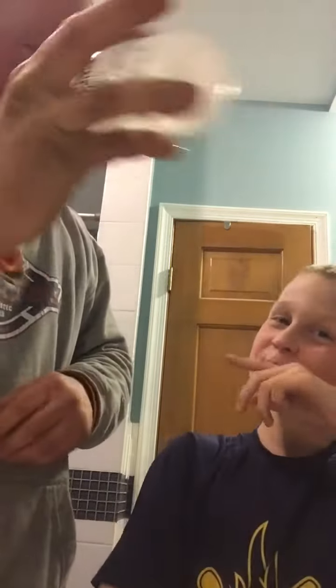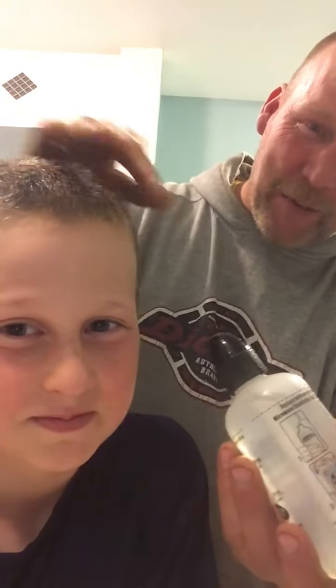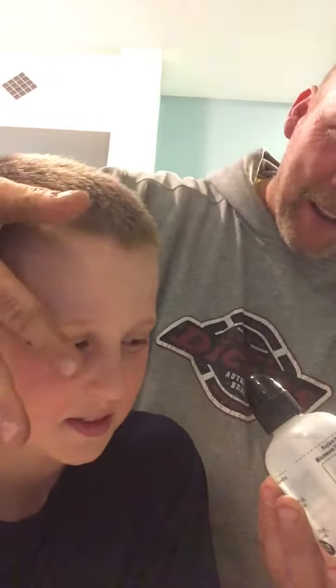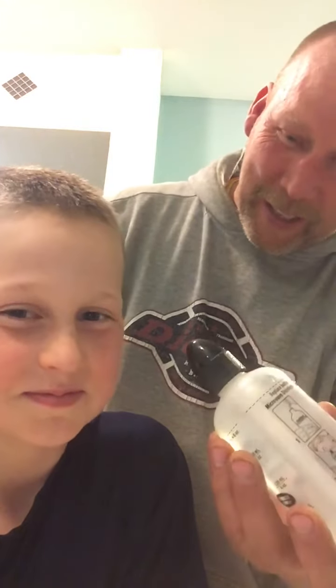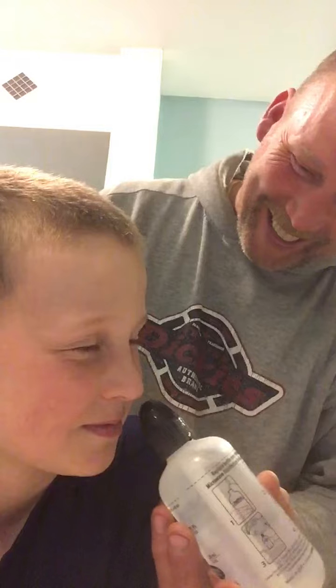You put it in one nostril and let it drain out the other. We're going to show Leanna how to do it. Lean her head this way — I'm going to put this in this nostril and squeeze it. As I squeeze it, it's going to fill the sinuses and then come out the opposite nostril. It's not the whole bottle; it's just going to start pouring out. It's a squeeze.